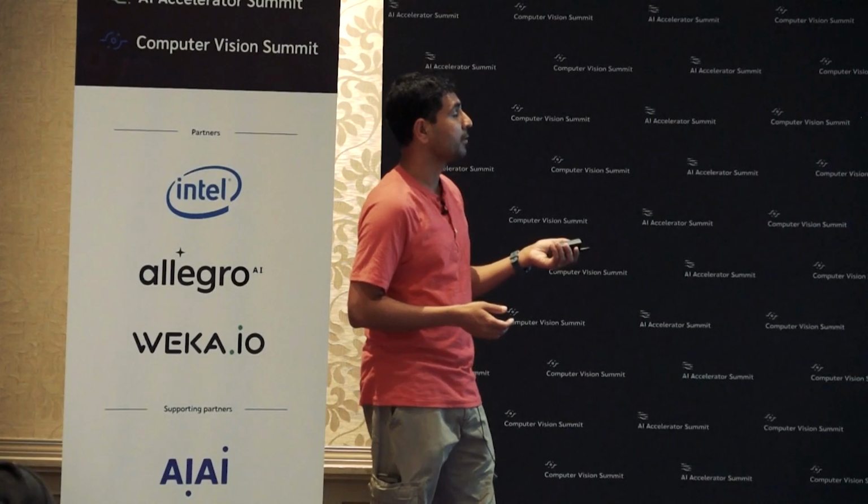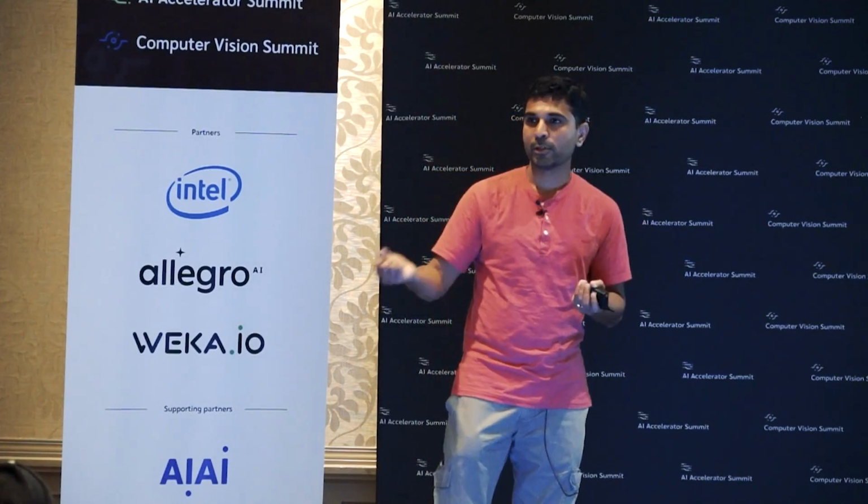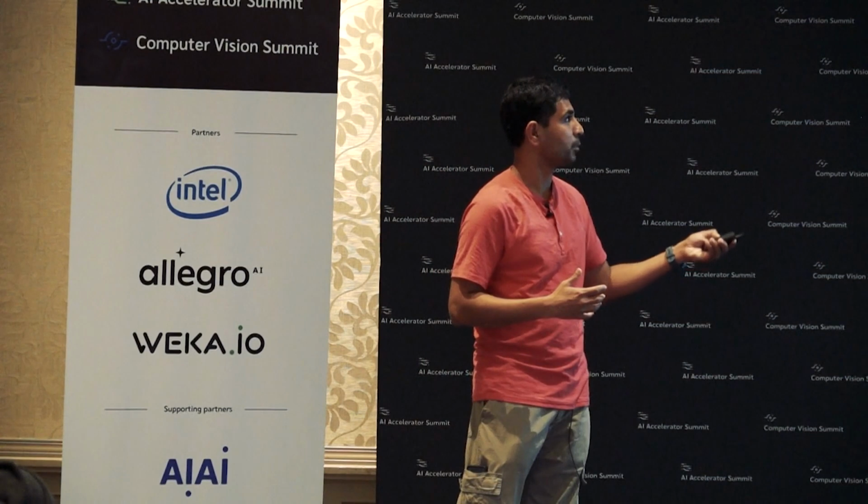But just for completeness, how you go about doing this kind of workflow detection is essentially by combining the different data sources. If you look at the Intuitive robot, for example, they don't just have the video data available. They also have what tool is being deployed, how the tool is being moved, and all of the sensor information. All of that can be fused, and you can imagine a sort of Markov state machine here, which combines the states of all of these different pieces of information to eventually tell you what is actually happening in the procedure, right?